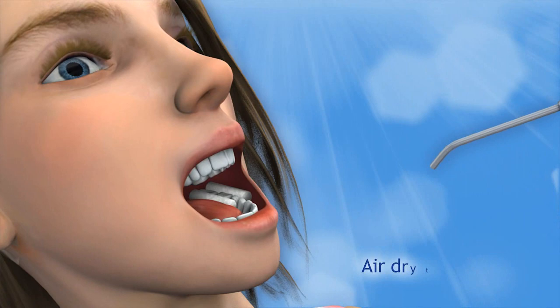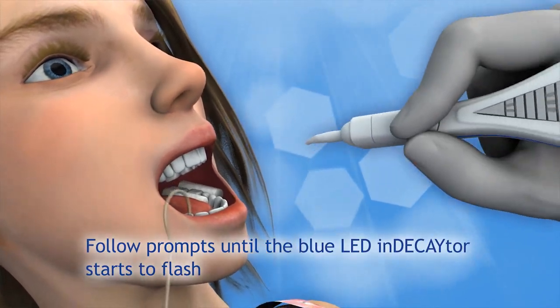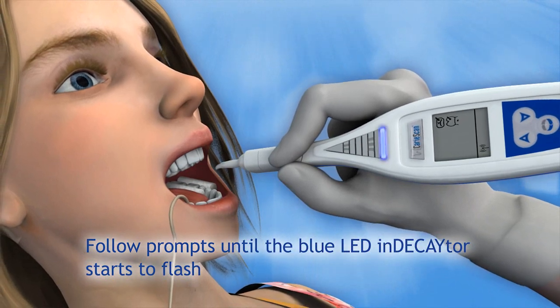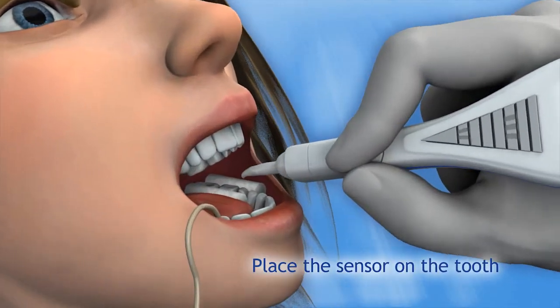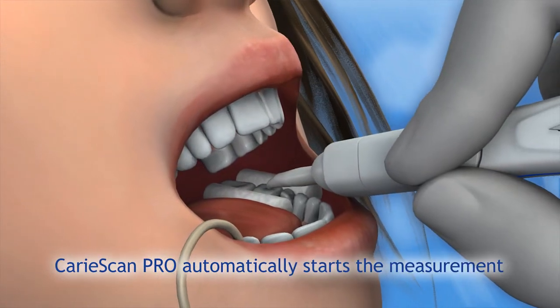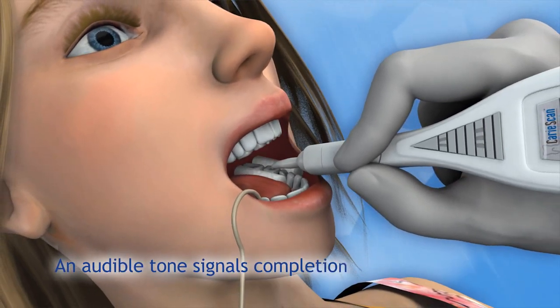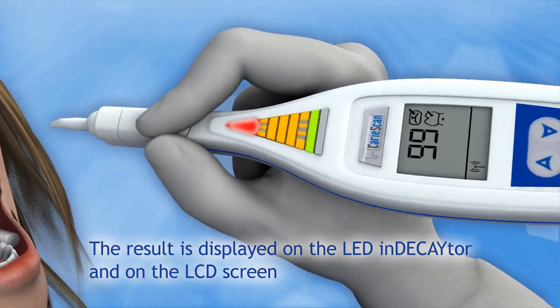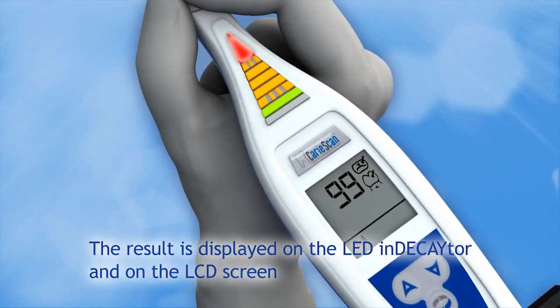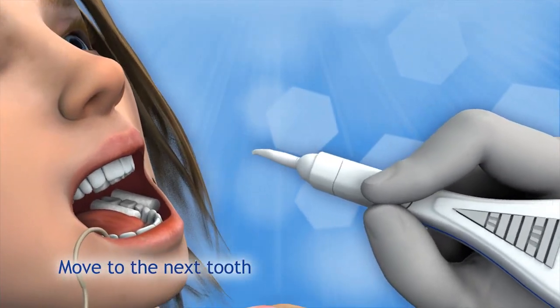Here's how it works. Air dry the tooth for 5 seconds. Follow a series of simple prompts until the blue LED indicator starts to flash. Place the sensor on the tooth. CarryScan Pro detects the tooth and automatically starts the measurement. An audible tone signals when the measurement is complete and the result is displayed on the LED indicator and on the LCD screen. To take another measurement, simply place the sensor onto another dried tooth surface.